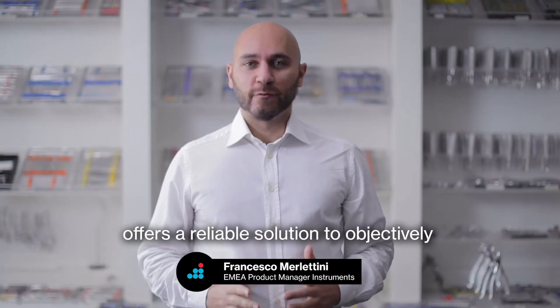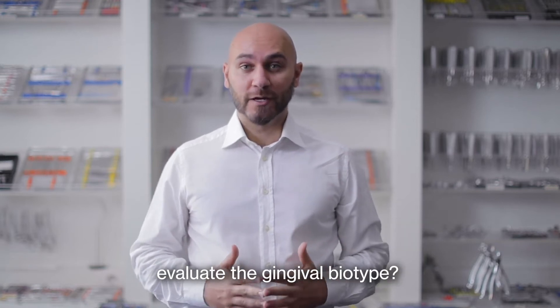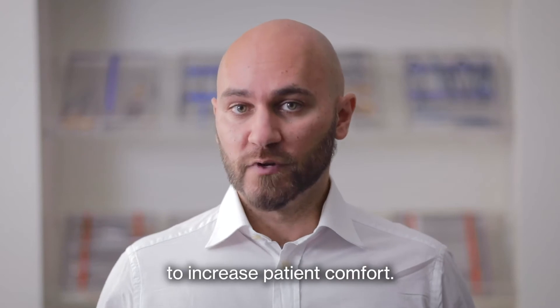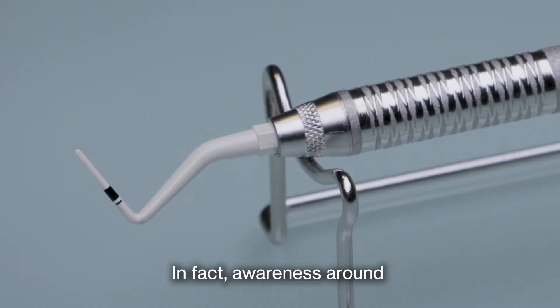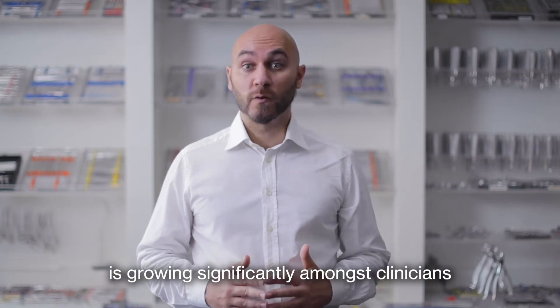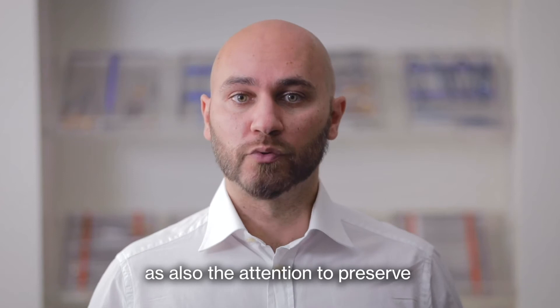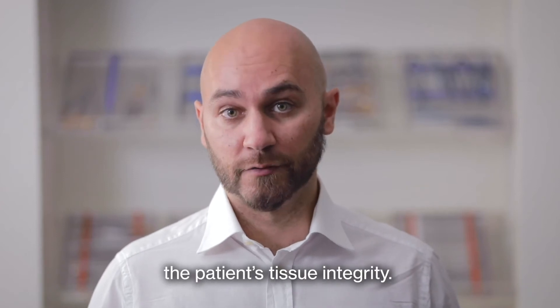Did you know that your 3D offers a reliable solution to objectively evaluate the gingival biotype? And all this is aimed to increase patient comfort. In fact, awareness around biotype-based periodontal therapy is growing significantly among clinicians, as also the attention to preserve the patient's tissue integrity.